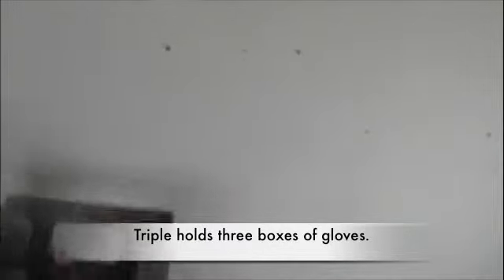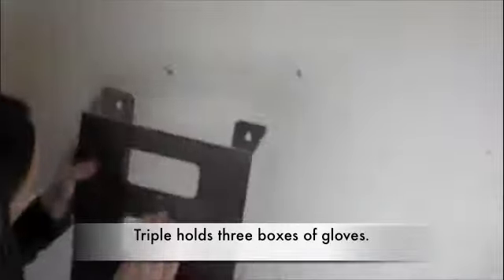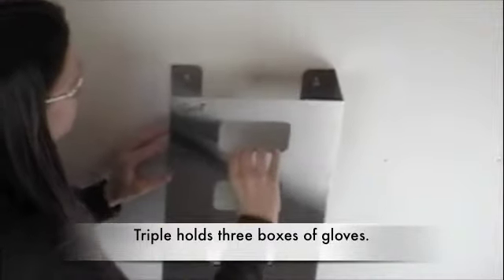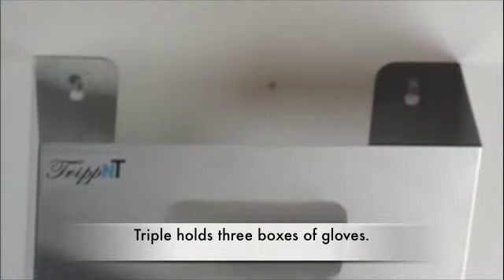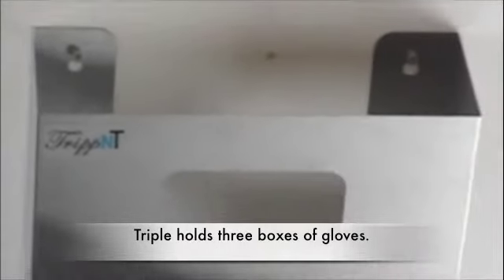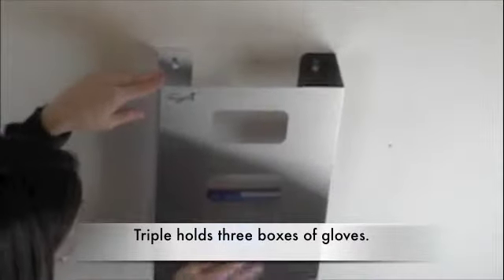And then the last one is the triple glove box holder with the four keyholes, the same distance between the keyholes, so that if you decide you need a larger size, then your installation screws will still fit. And there's one box of gloves.